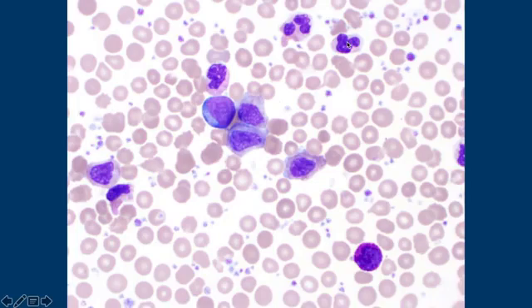I would say seg because I can see there's a little fold there. That's just a funny fold. Either a meta or a myelocyte. It's sort of got that dawning of neutrophilia. Oh, I remember hearing that a long time ago. And then that's a blast. So they're all myeloid precursor cells at different stages.